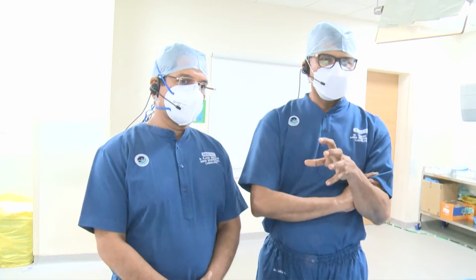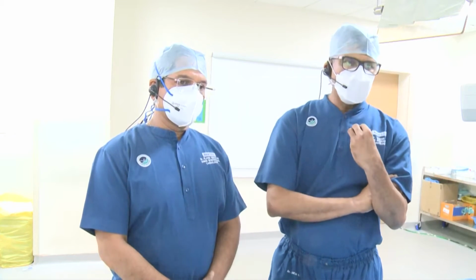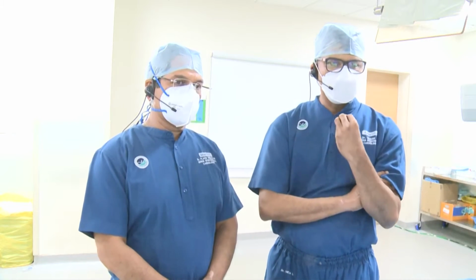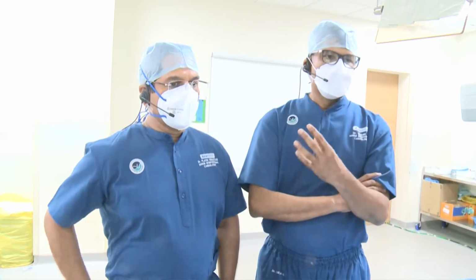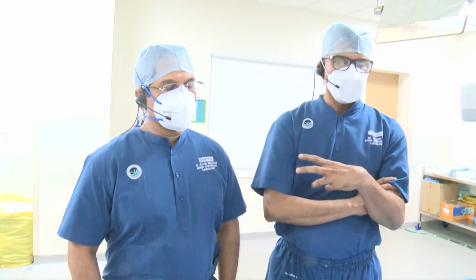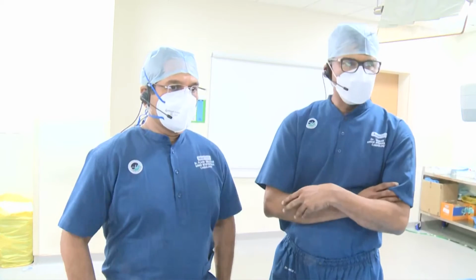So our plan was to do an image-based left main coronary artery intervention. Angiographically, our concern is whether the circumflex ostium is involved or not. So whether we should go for a provisional stenting strategy, or go straight away for a two-stent strategy. Anyway, the imaging will give an idea about it. Over to Placid for our plans.